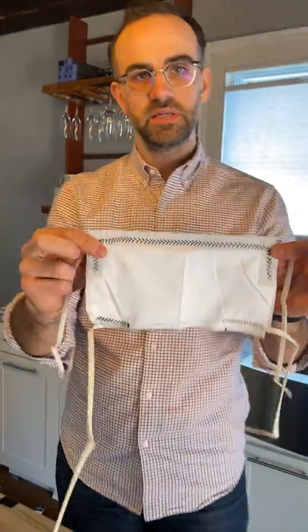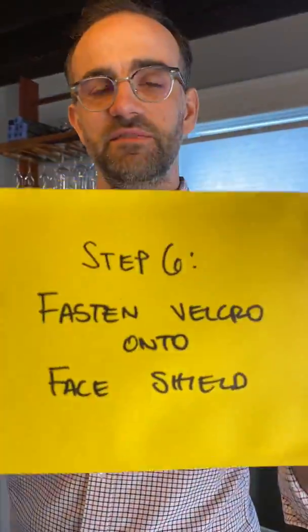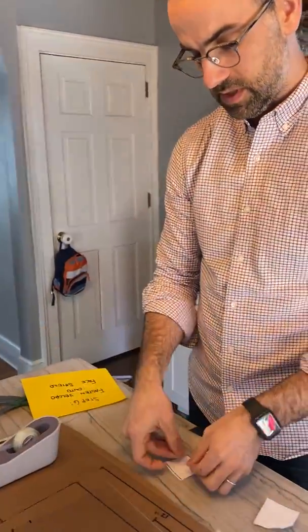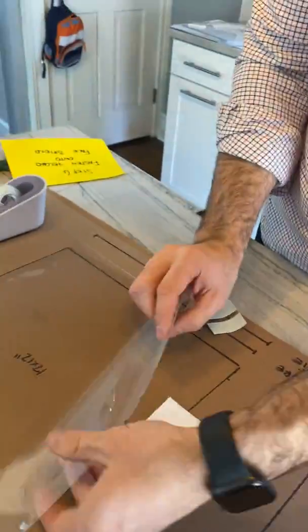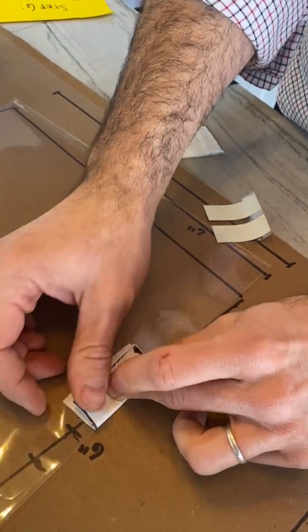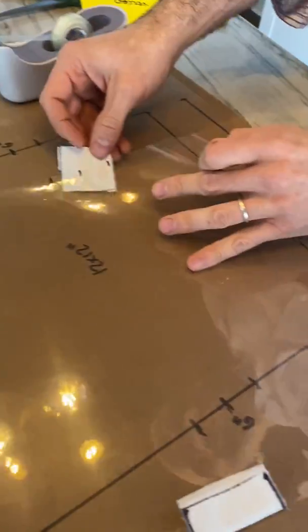Now we have the whole upper and lower mask sorted. Step six: fasten velcro onto the face shield. This is the face shield — the clear piece of plastic — and here are our two 2-by-2 squares. What we want to do is put some two-sided tape on the other side. I did this without the two-sided tape and it worked fine, just a little harder. Here's where our dots really help — you can position these dots just so, and then fold over the fabric just like that.